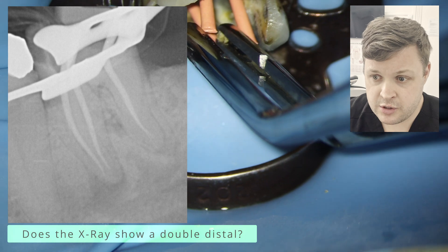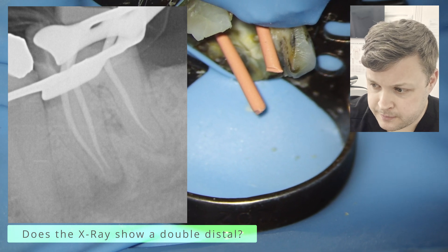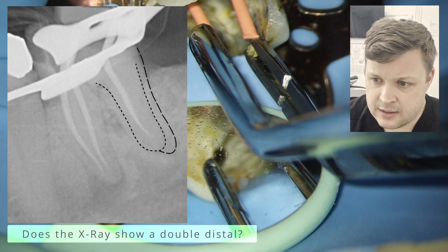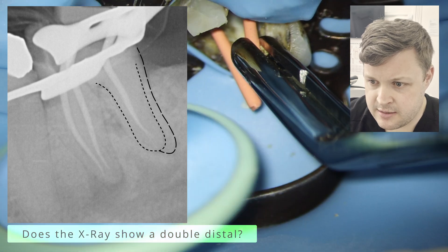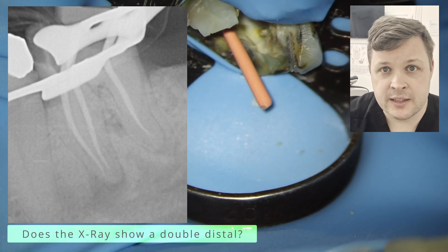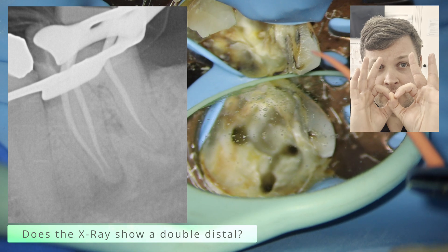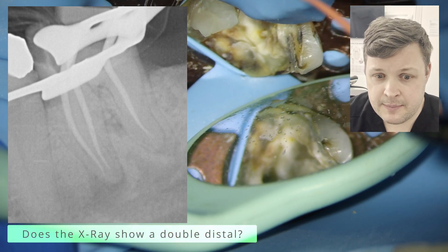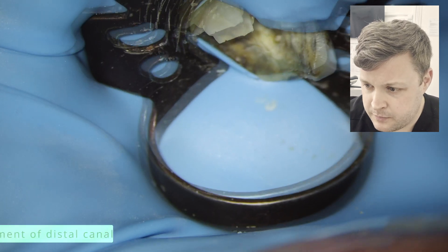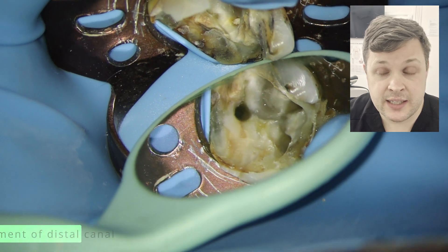Looking at the cone fit radiograph, I can see that all three GP cones are short. Sometimes we think it might be the radiographic apex, but these are all clearly short. I also notice there may be a second root on the distal. Sometimes you get a figure-of-eight root morphology that looks like a double root, but it's actually two tubes very close together giving the suggestion of two roots. I think there might be a second distal canal and it's prudent to have a look.